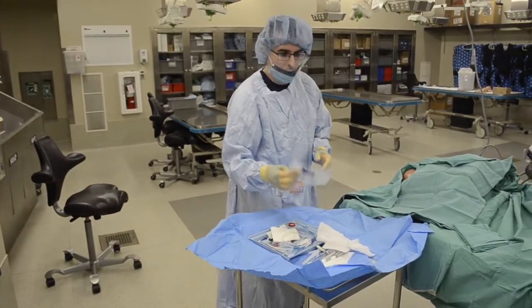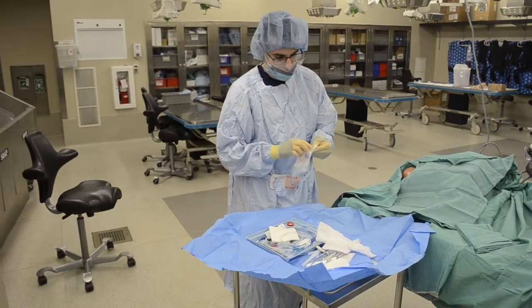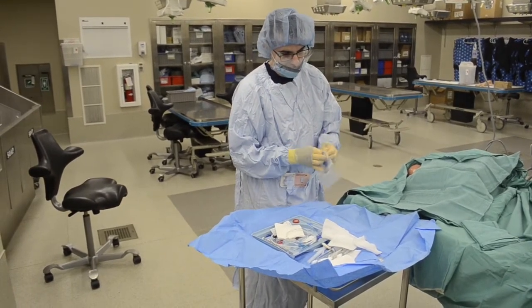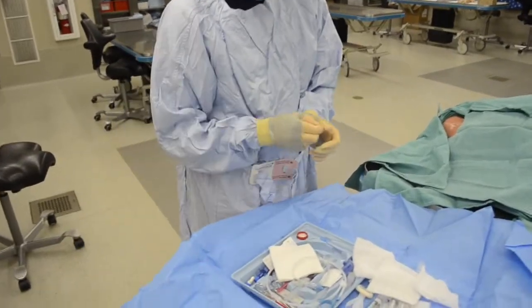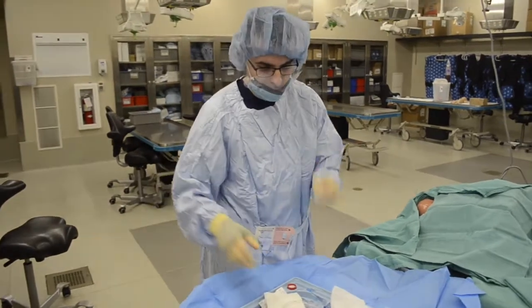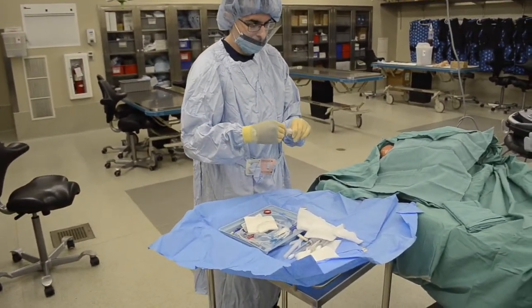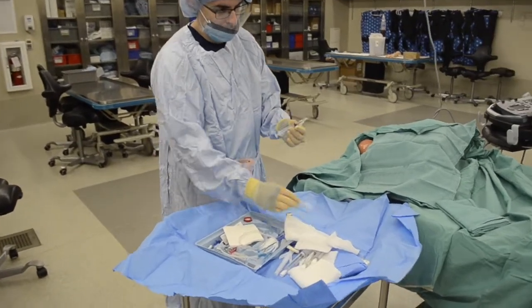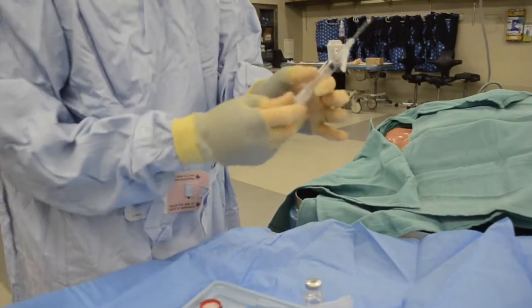So if the patient is awake, we should use some numbing medicine. So this kit comes with lidocaine. We'll pop the cover. And this is the one that we can use for drawing up lidocaine and for injecting.